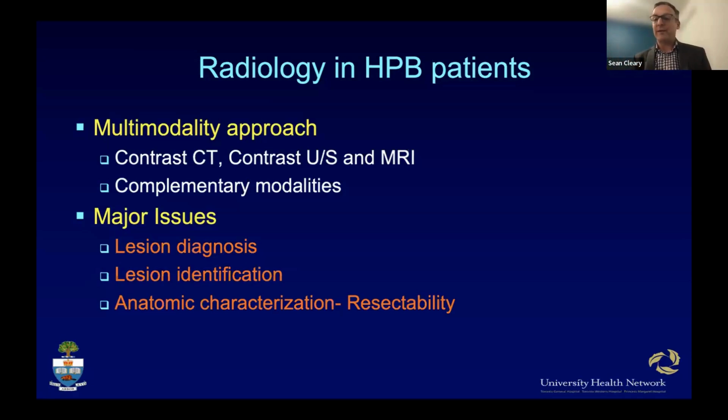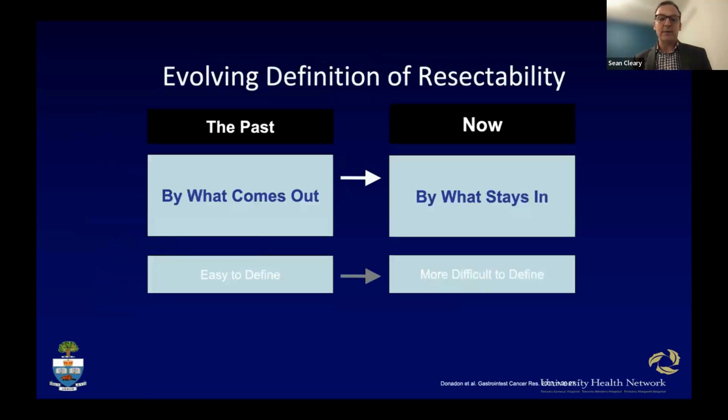First is lesion identification. The second is lesion diagnosis. And then the third is anatomic characterization with relationship to the intrahepatic structures. And that really goes to the assessment of resectability.